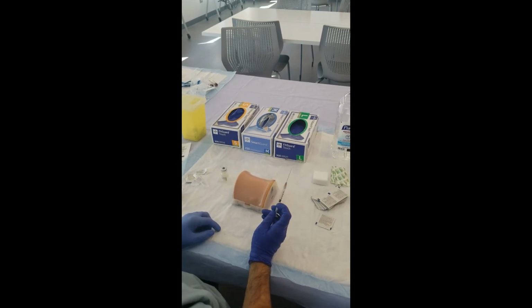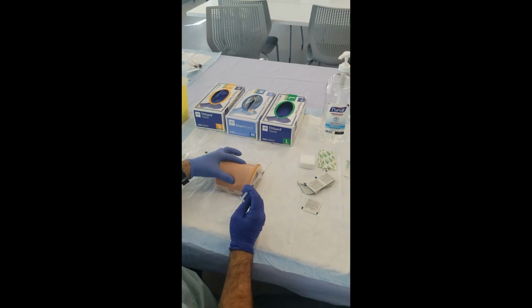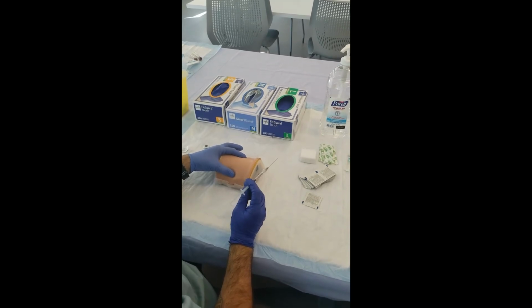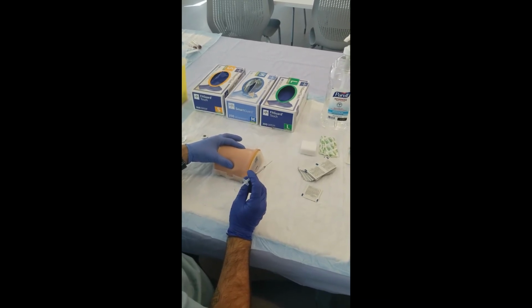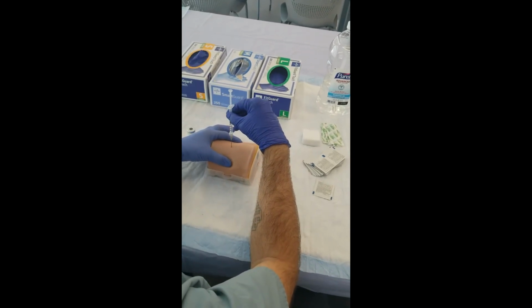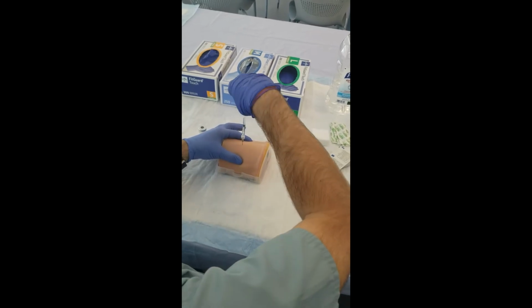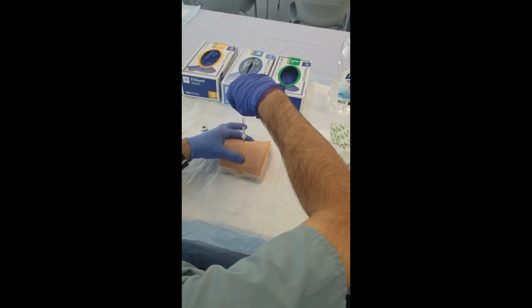Step 38. Held skin taut with thumb and forefinger to compress subcutaneous tissue and ensured needle entered muscle. Step 39. Inserted needle at a 90-degree angle. Step 40. Drew back slightly on plunger to ensure needle was not in a blood vessel, then injected fluid.